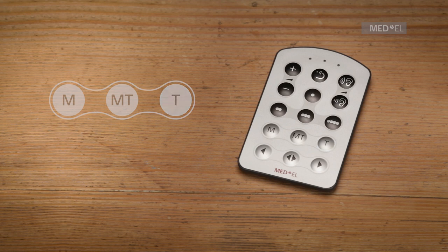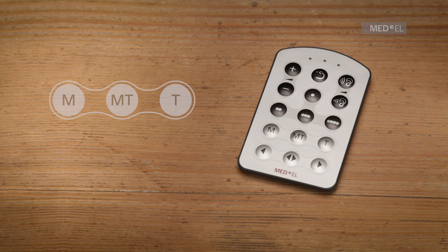To select a combination of telecoil and microphone input, press the MT key. To return to microphone only input, press the M key.